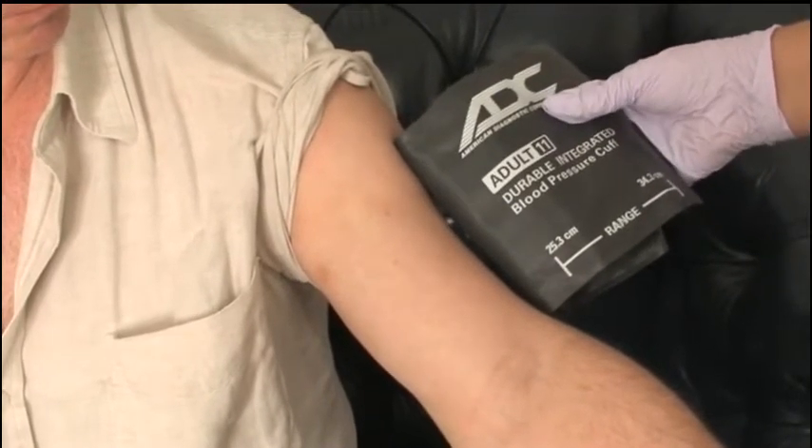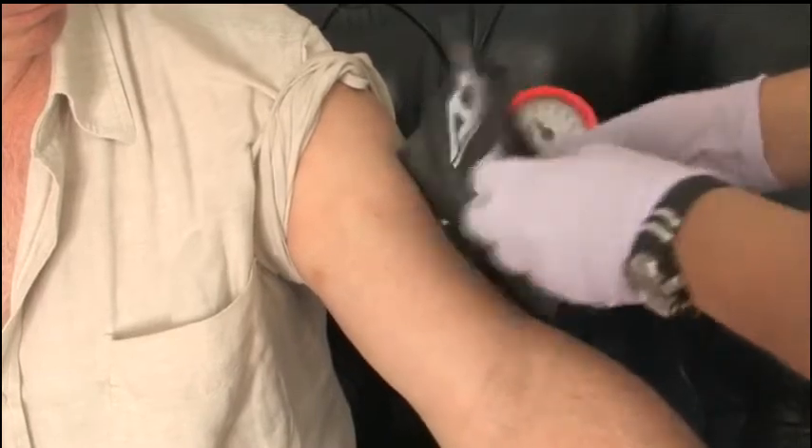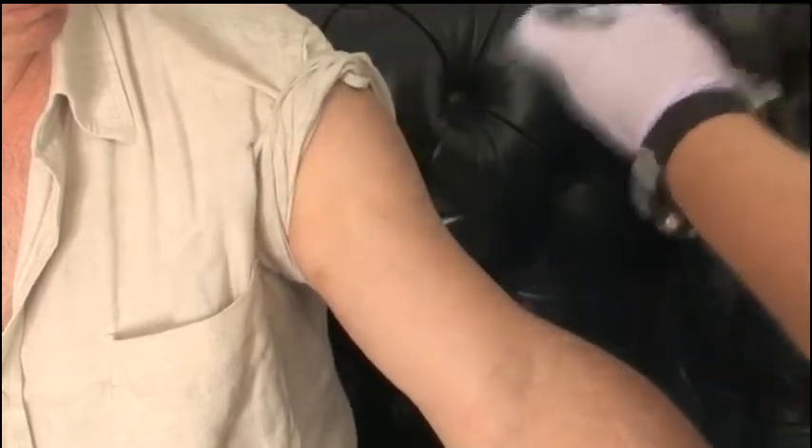Select the appropriate size BP cuff. The cuff should measure two-thirds of the length of the upper arm, from elbow to shoulder. Additionally, it should be long enough to fasten the Velcro securely when the cuff is placed circumferentially around the arm.